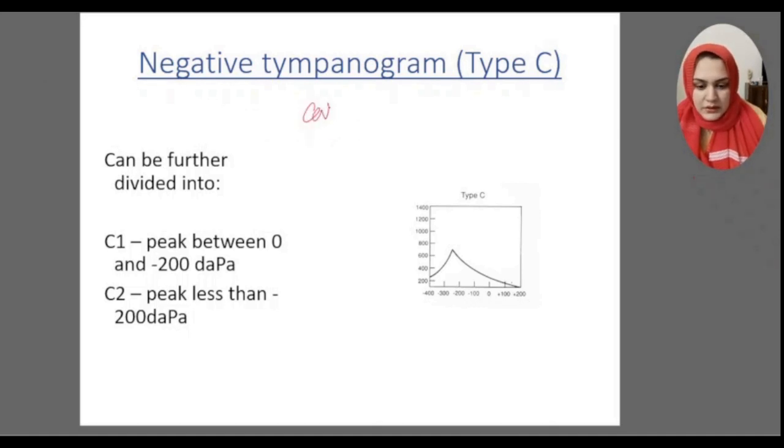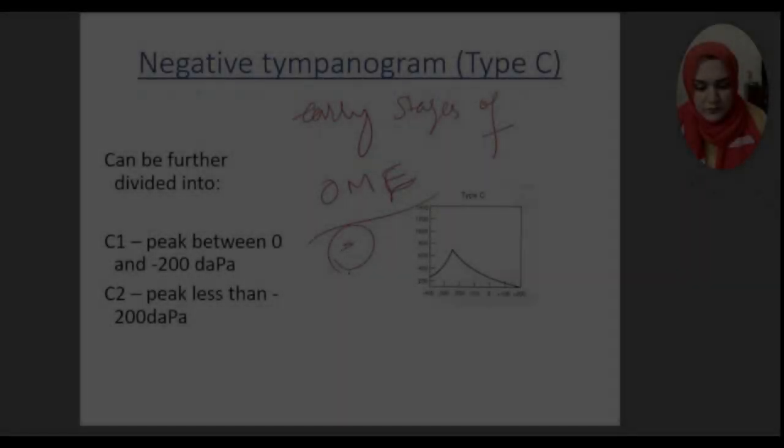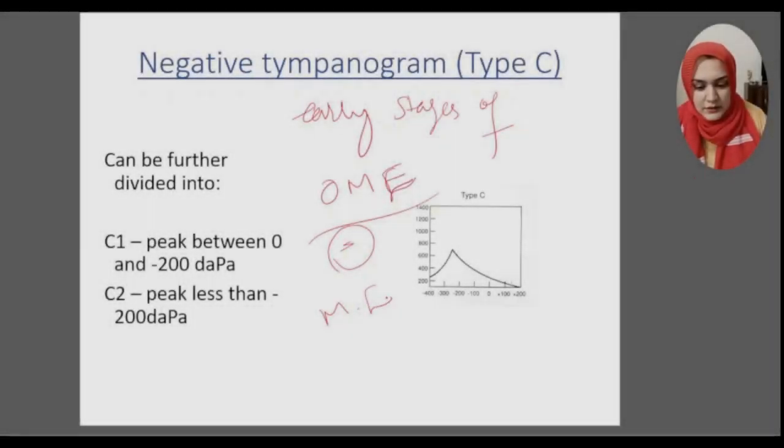And in early stages of otitis media with effusion, there is negative pressure in the middle ear cleft.